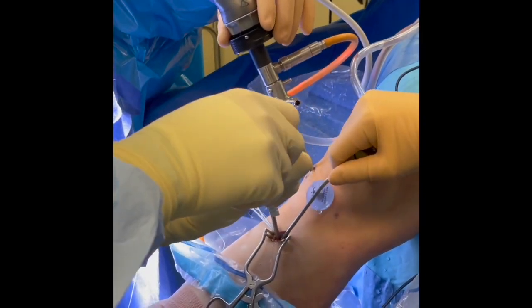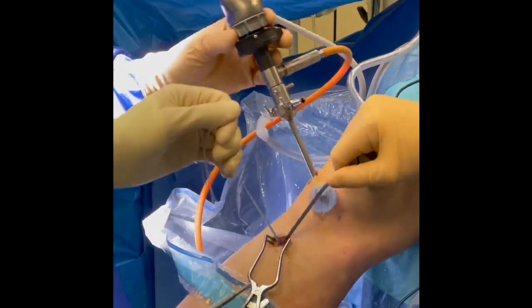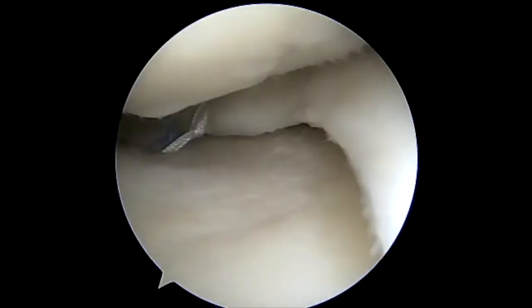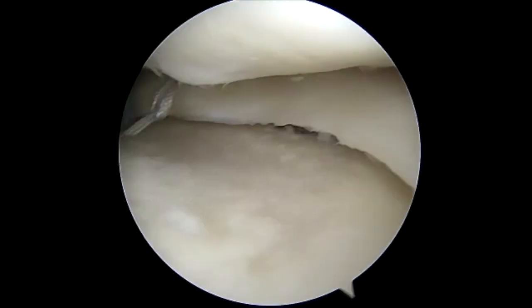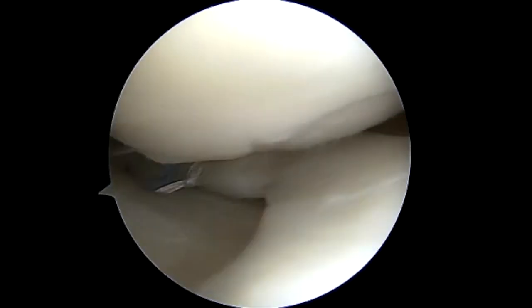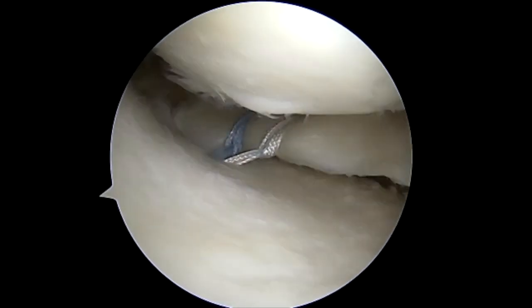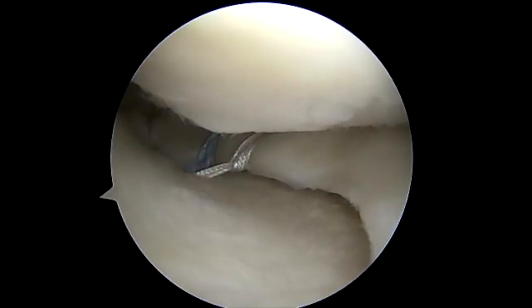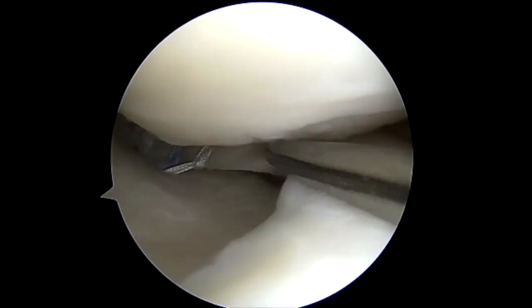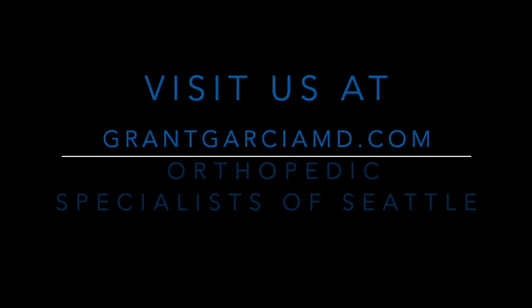Once it's confirmed to be the appropriate depth, we can remove it easily and then check the pullout strength. You can see how we've fixed the final construct — both the peripheral extrusion stitch as well as the root stitches are tightened, and there is excellent tension. We've reduced the meniscus back to its fixation site. In addition, you can see we've pulled the meniscus over the plateau for the centralization stitch, with good tension, and this will overall reduce the meniscus extrusion.